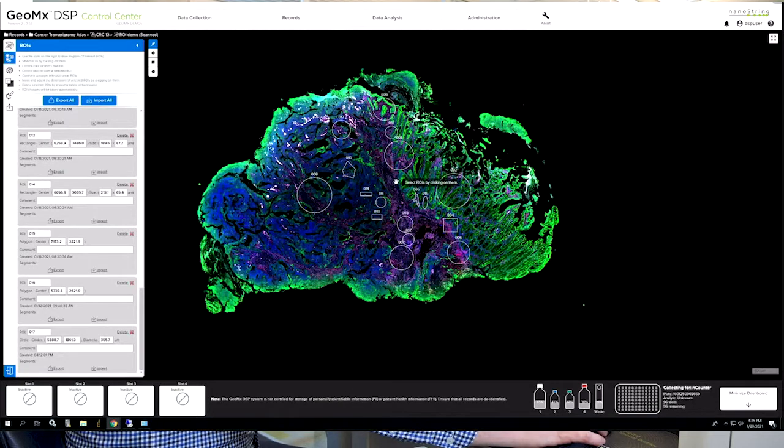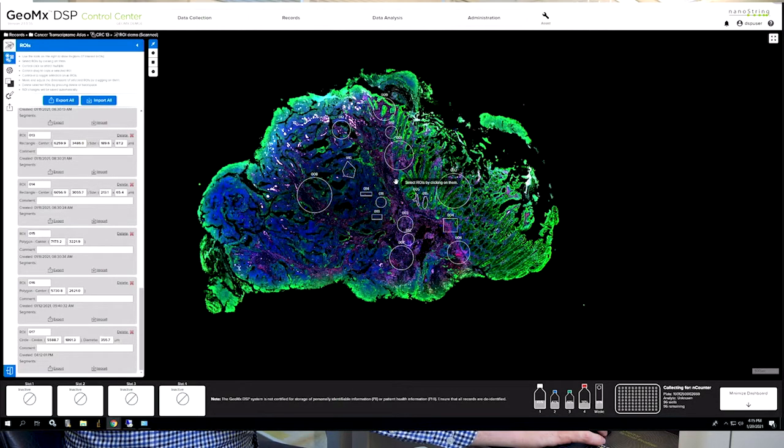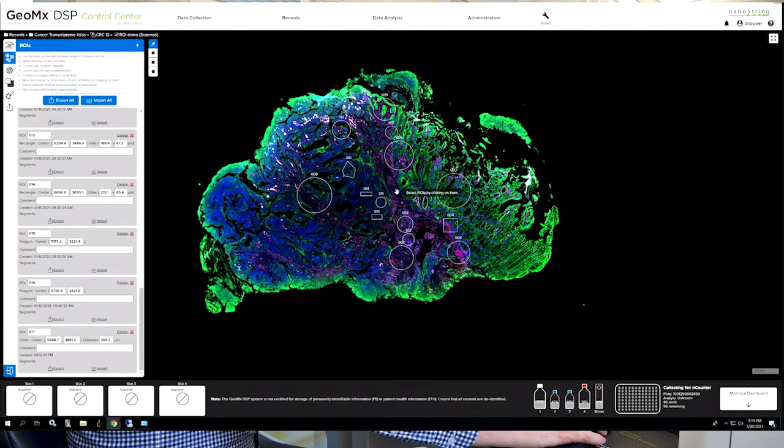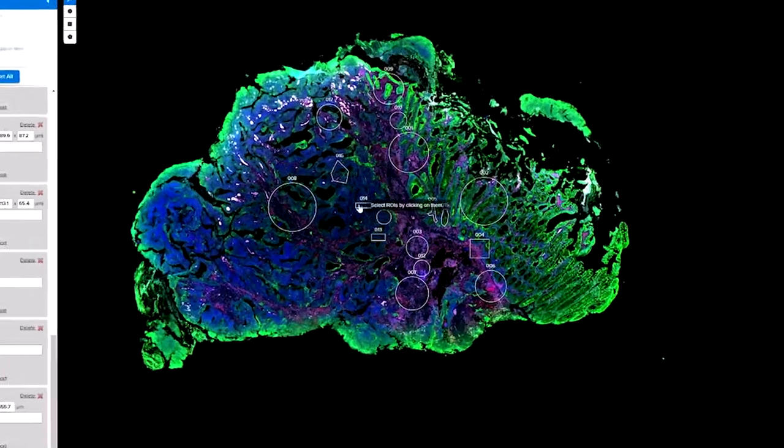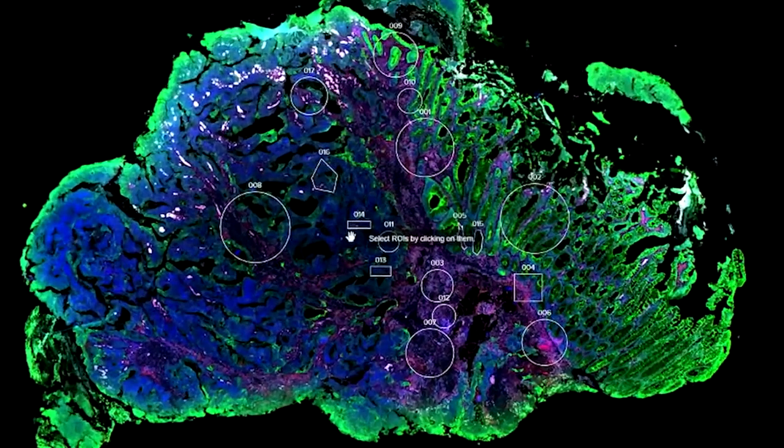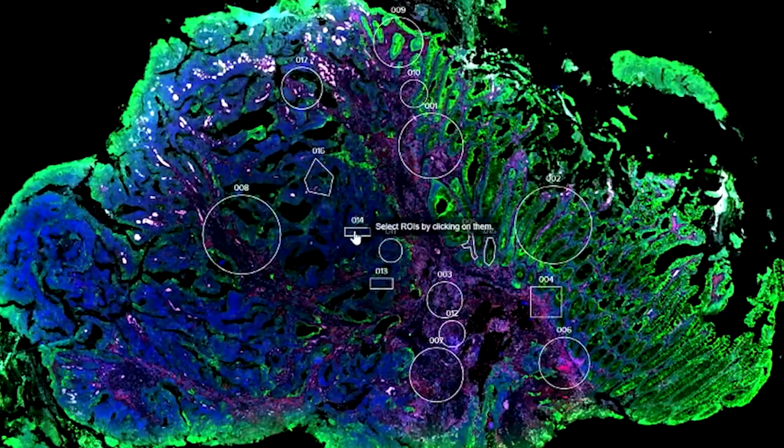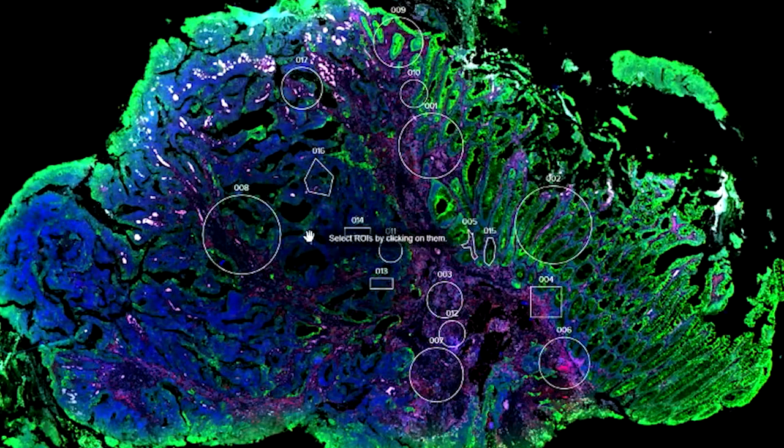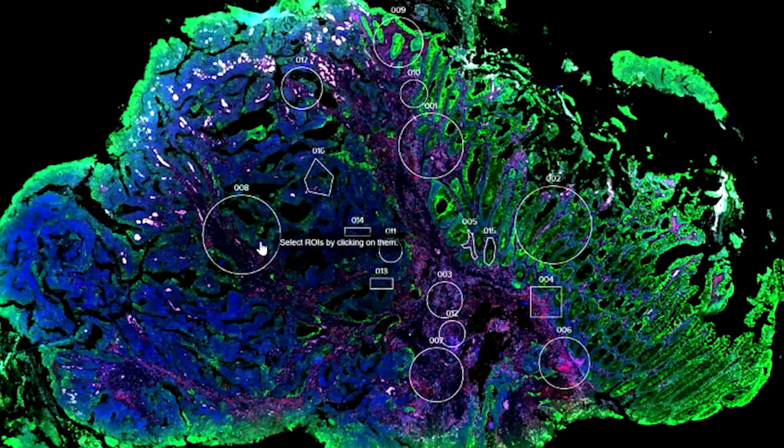As the user, you can choose these ROIs from anywhere on your laptop. Geometric profiling allows us to choose circles, squares, or even polygons.